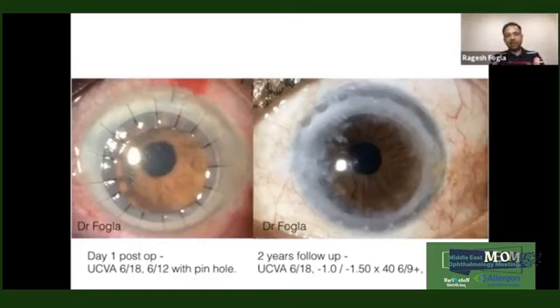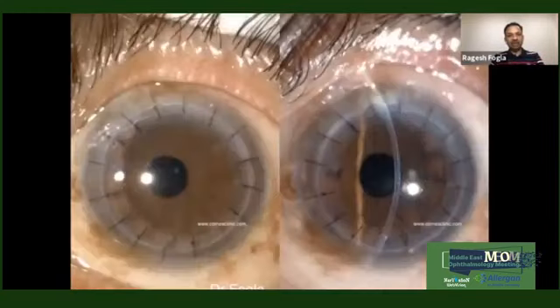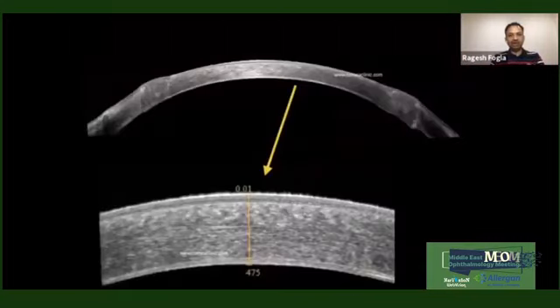The advantage was that this was an eye with a short axial length, only eye. Doing a triple procedure sometimes carries the risk because it's a short eye, and even if you try to do it under local anesthesia, there can be an upthrust. The risk of expulsive hemorrhage can also be there. Whereas here, doing a DALK with a phaco-IOL, we were able to keep the chamber closed and perform the surgery in a closed chamber. There's another case with corneal opacity where we did a DALK with a phaco-IOL, and you can see that the outcome is pretty good.